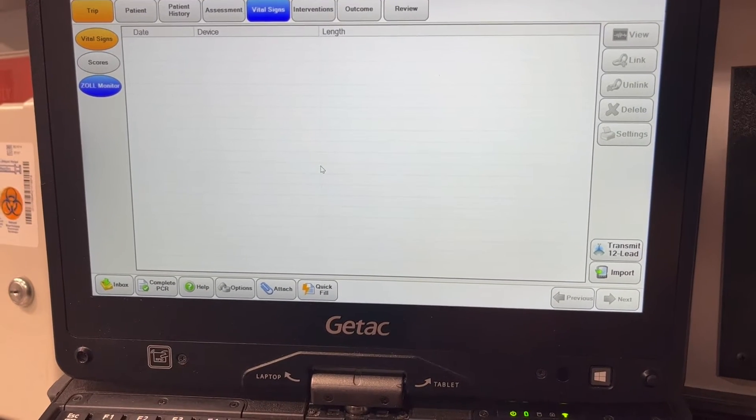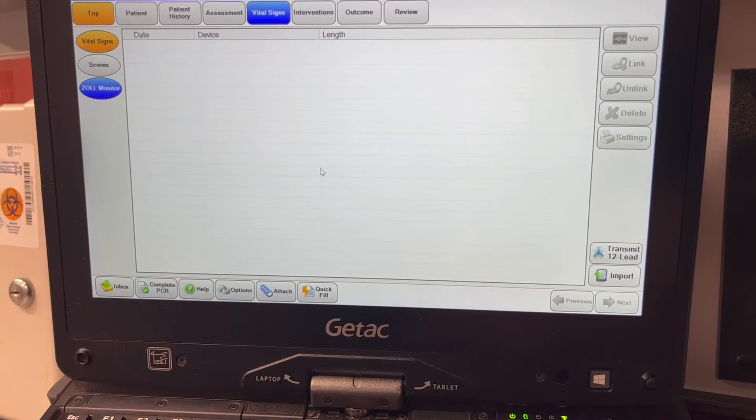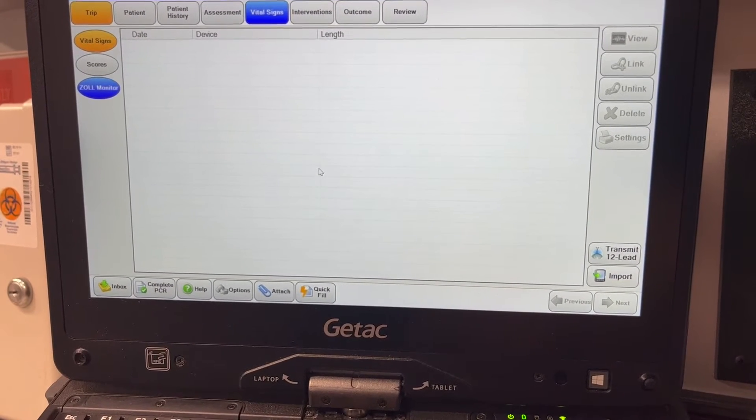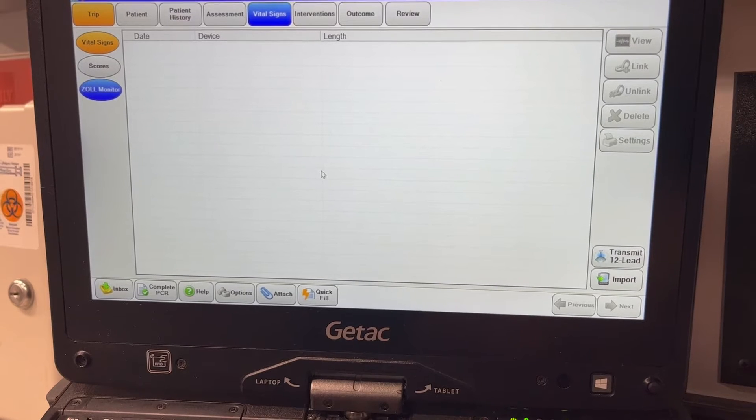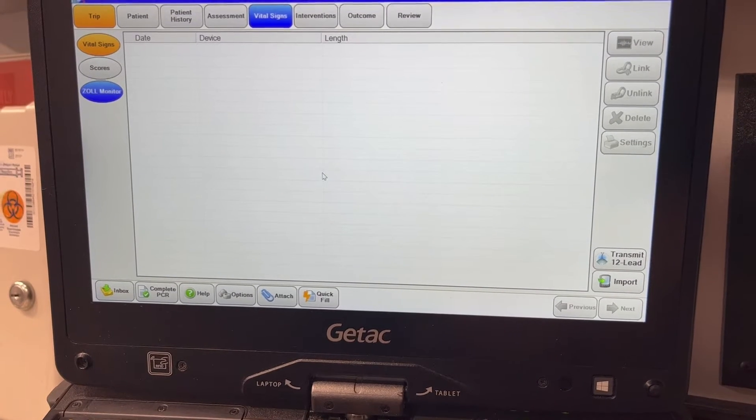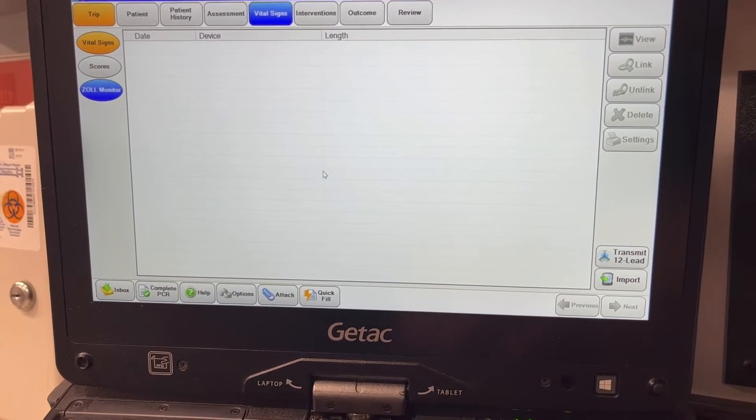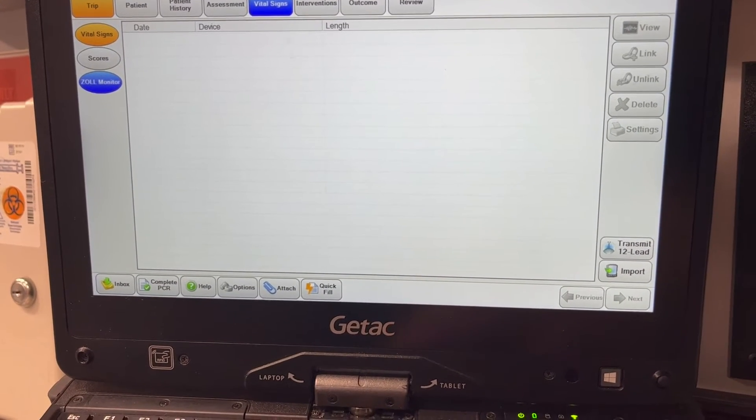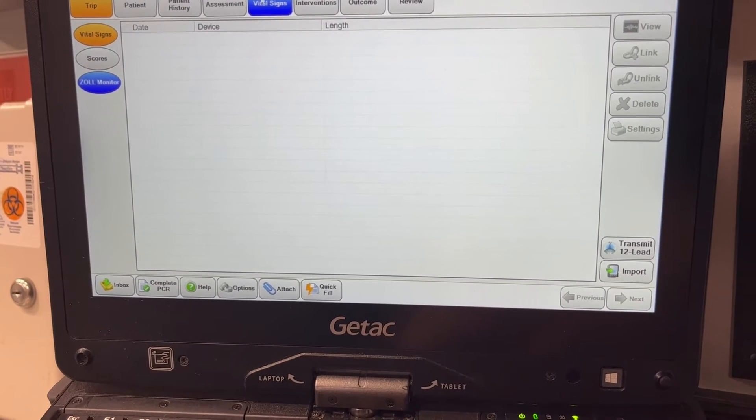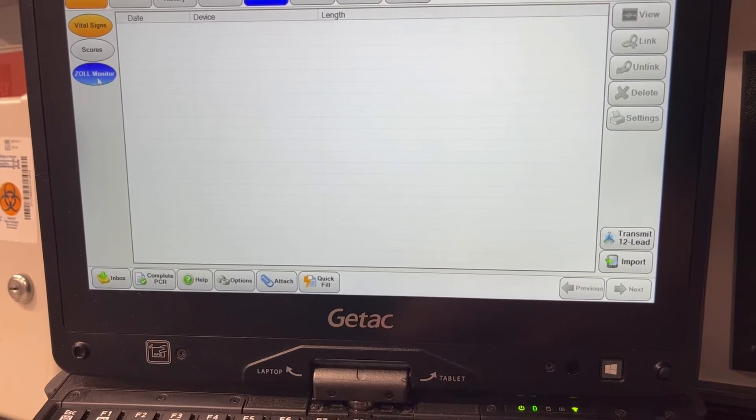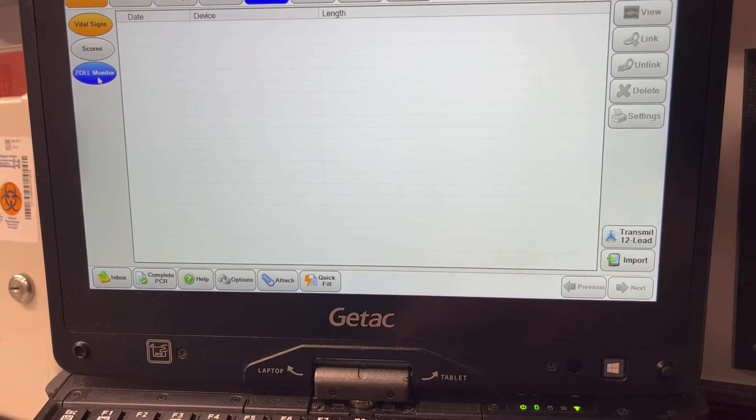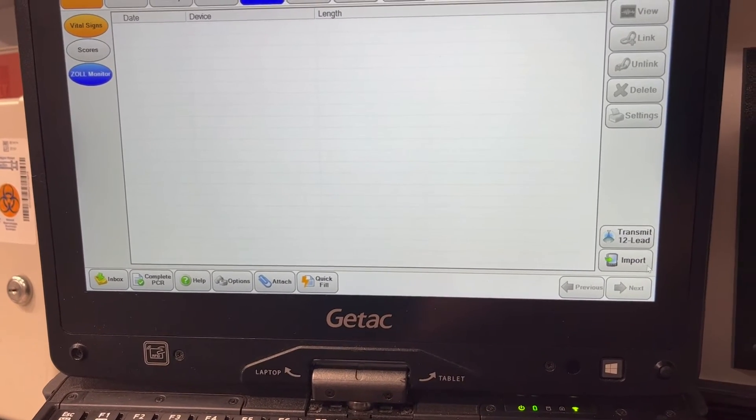Hey everybody, I'm just going to show you quick the steps to upload from the Zoll cardiac monitor. Once you've sent the file from the monitor, you're going to go into your EPCR, click on vital signs, Zoll monitor, and then import.